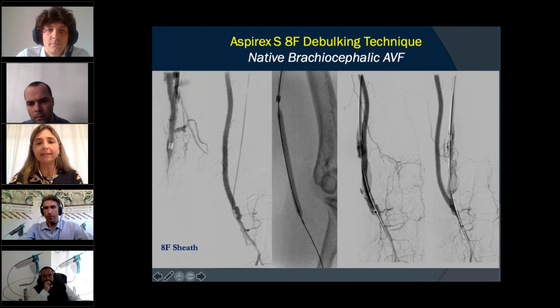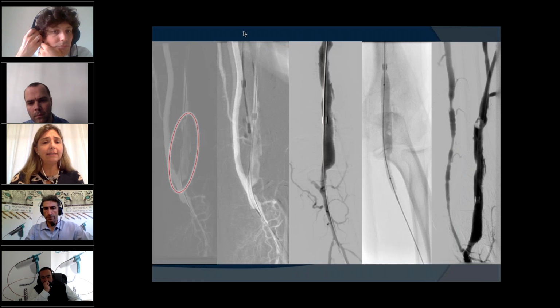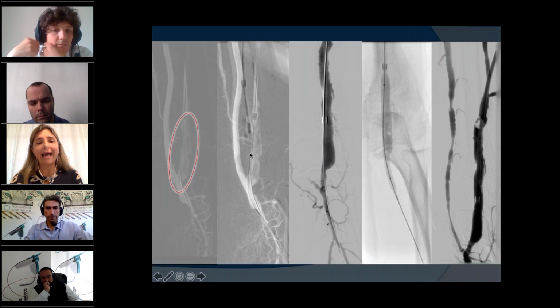This is the first incidence, and we dissociate both arterial and venous outflow, and we can see the clotted proximal area. This was done with a 5 mm balloon, the predilation. So this is a road mapping that's used to guide our thrombectomy system, and this is the occluded area. This is the site of puncture, the retrograde puncture. And this is the 8 French sheath. This is the device going through the clotted area.